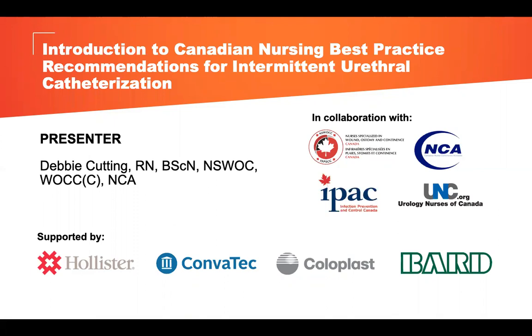A lot of the studies are a mixed bag, but certainly the risk of urethral trauma, and the need for hydrophilic coating and pre-lubricated catheters, is more important in the male patient, only because the male urethra is so much longer to traverse, with more bends along the way and more areas where you may come into problems. So it's not an issue of men versus women, but I do think the literature would tend to support the use of hydrophilic catheters more strongly in men, because they're probably going to be more prone to having challenges.